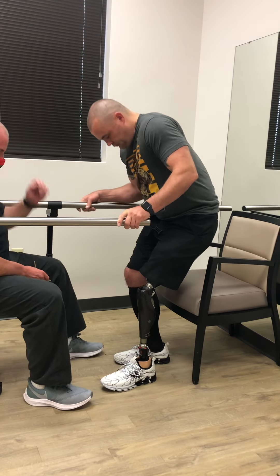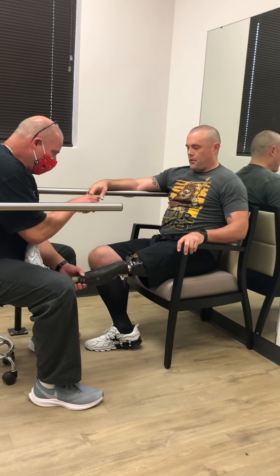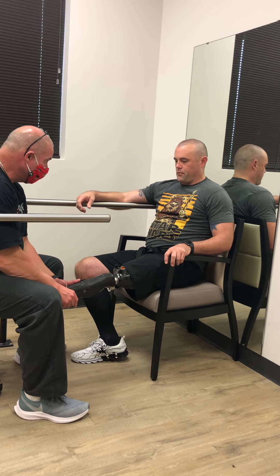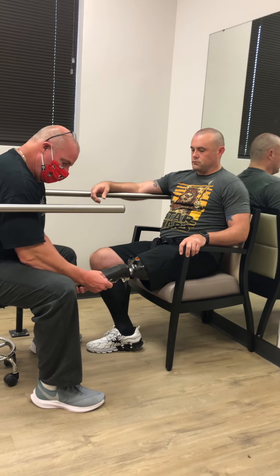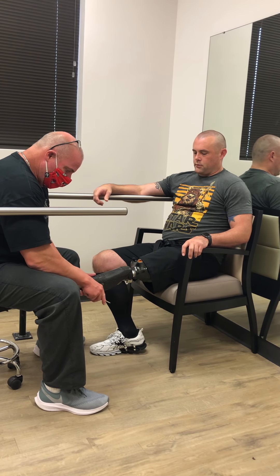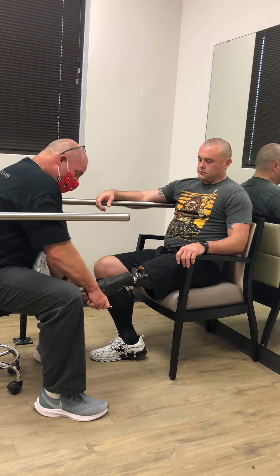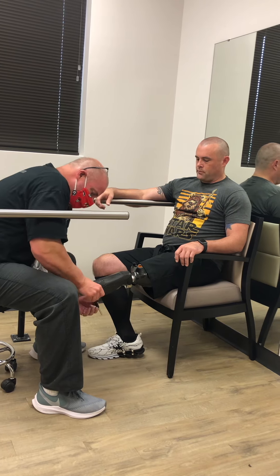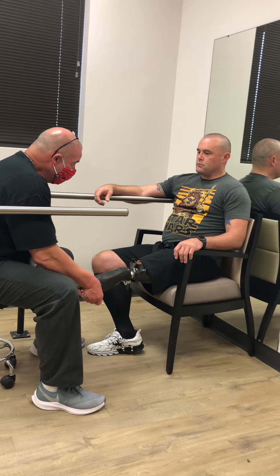Let's give you a little bit more length. What I'll do is take the whole socket — everything — and adjust the medial side. Then we'll bring the computer in and give you some help with programming. The good news is we're getting a little extra room here, so potentially we might be able to put the rotator in there for you.